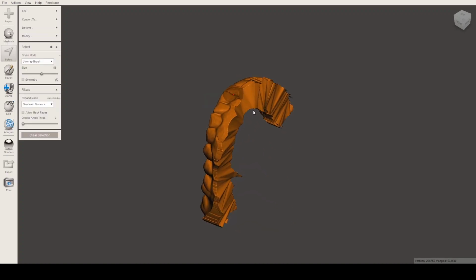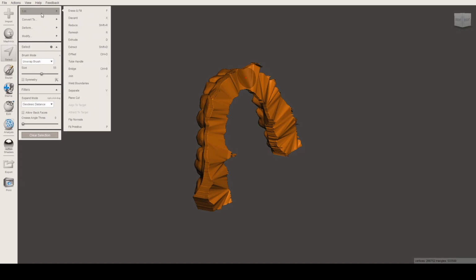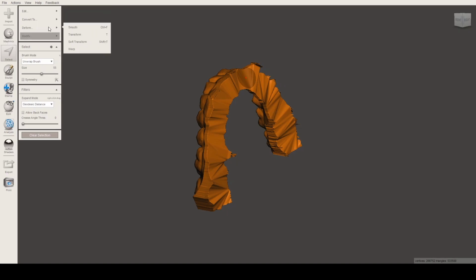You can double click and it will select all. So just click select and double click on the object and then it will select all automatically for you. We have here our options, our edit, and we want to transform it. Where's the transform? There. Transform is in the deform menu of your select tool. So transform. I want to transform it.